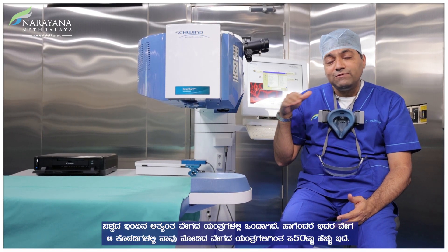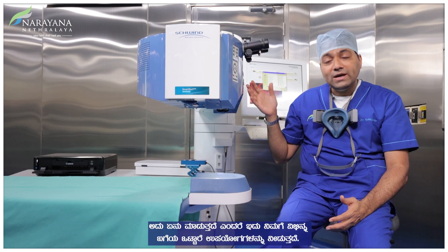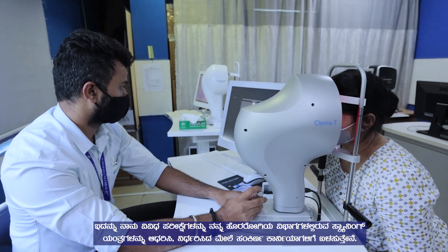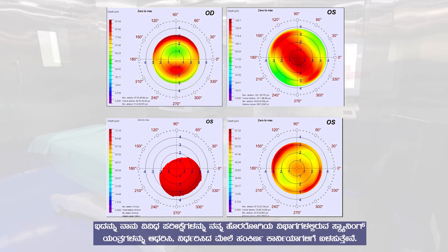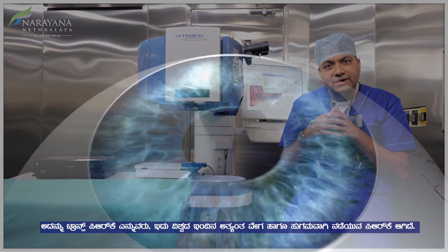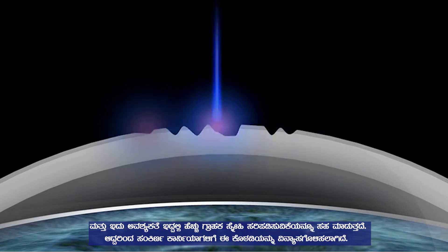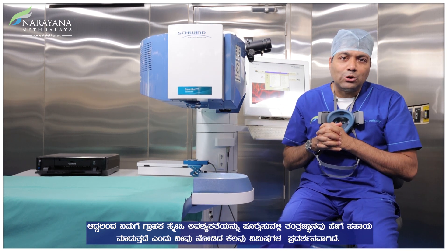What it does is give you a completely different profiling altogether. I use this for complex corneas, which I identify based on tests done in my outpatient department with scanning machines. It can do a lot of laser treatment on keratoconus, a surface ablation called trans-PRK — one of the fastest and smoothest PRKs in the world today — and also customized re-correction if needed. So this OT is designed only for customized and complex corneas.